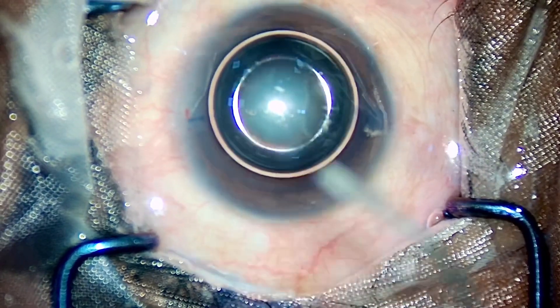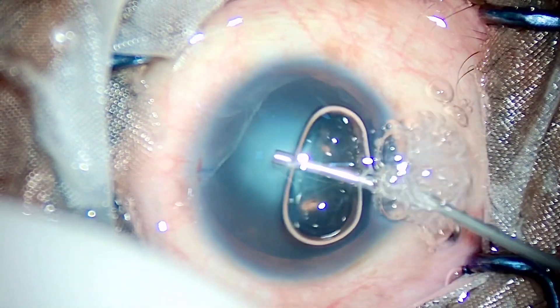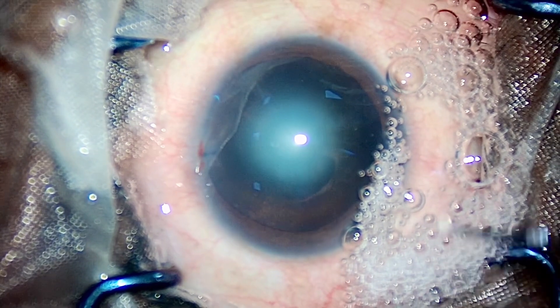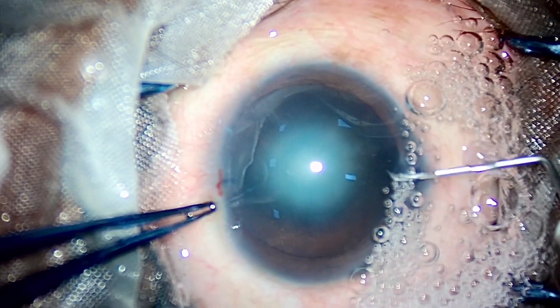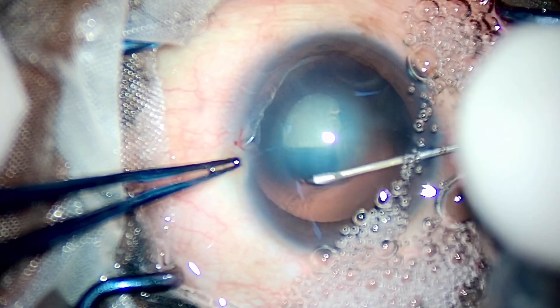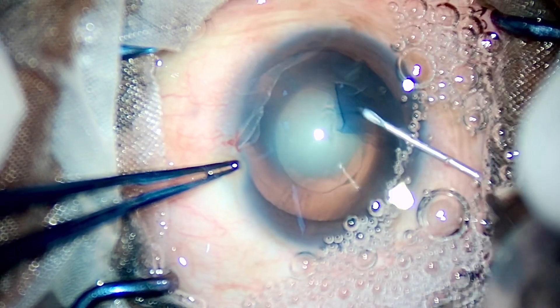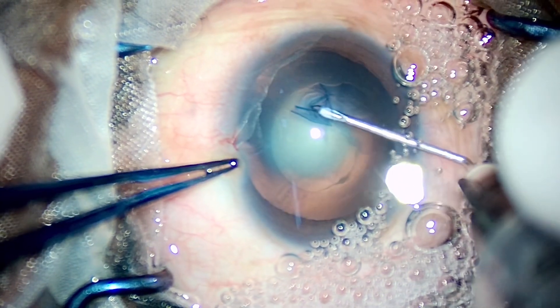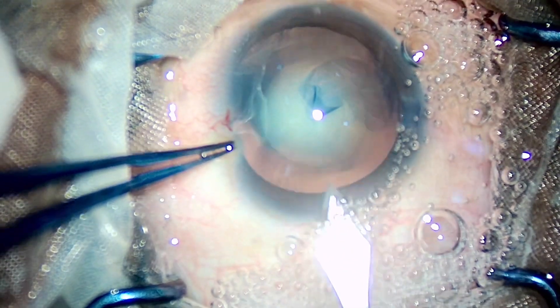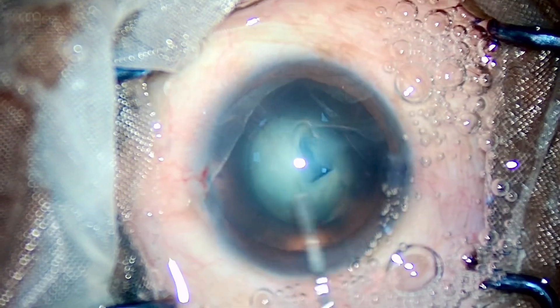I have started the case, made the sideports, injected some dye, extended the anterior capsule, and expressed the air bubble out. This video features three key learning aspects that I'll point out one by one. For now, you should keep a close watch on the chopping maneuvers during the phaco part and the status of the posterior capsule. You all need to tell me where and how I ruptured it — one of the most interesting cases that took me back in real time.